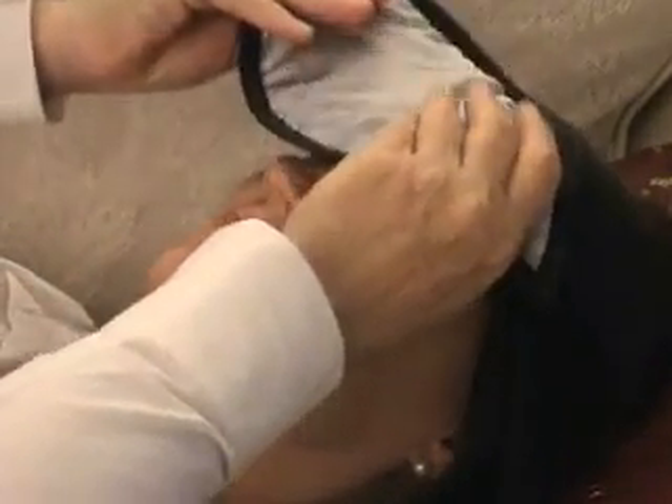Lie down and place the eye bag over your closed eyes, choosing whichever side you prefer. Mould the bag to comfortably cover both eyes. Remove the eye bag for a few moments if it feels too hot. Relax with the eye bag over your closed eyes for 10 minutes.